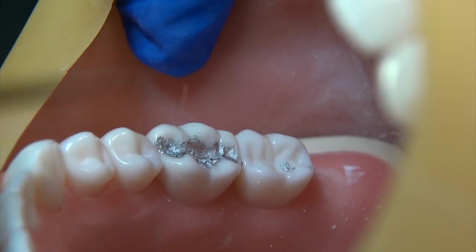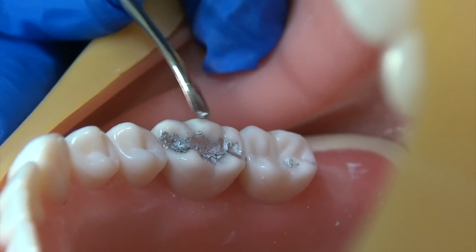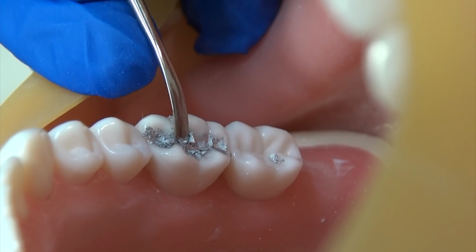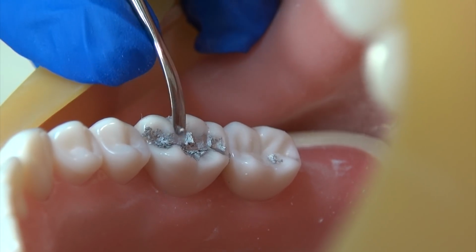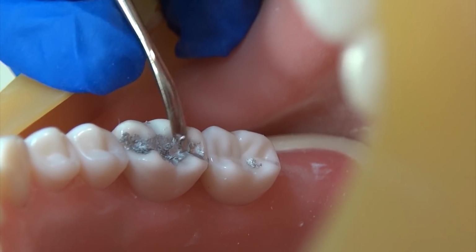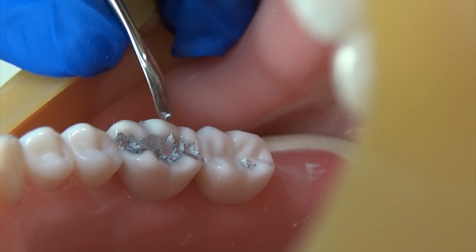Another way to utilize this instrument is the tail aspect of it. So you can come down, and so I'm coming from the natural tooth structure. So this is how I'm really going to try to make sure that I'm not submarginating or supermarginating.